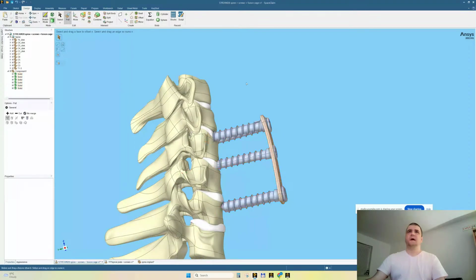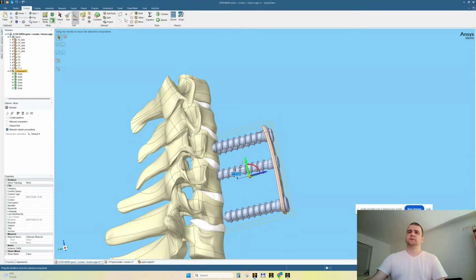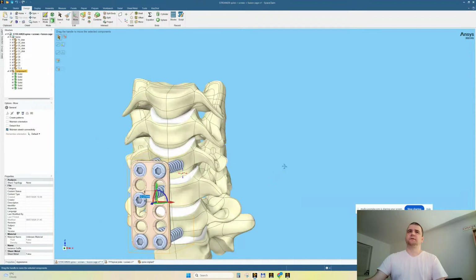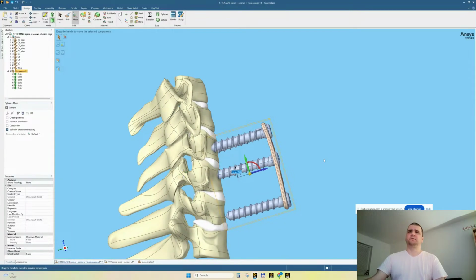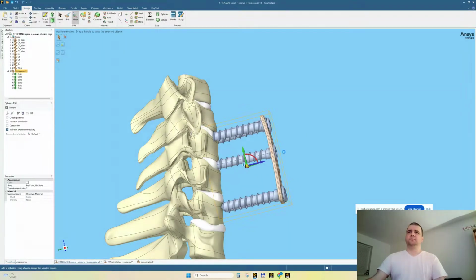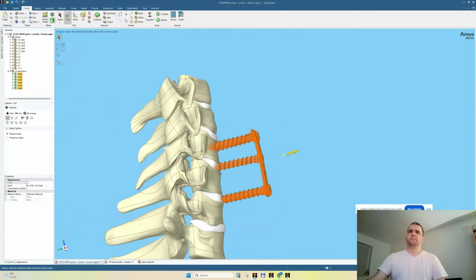All right. Now let's go on Move. Select the subassembly, and let's move it. I think we can do even better. Or do we leave it like this? Let's scale another 0.9. So instead of the 0.85 that I said, let's make it 0.65. I think it's an overkill, so let's go again with 1.1.